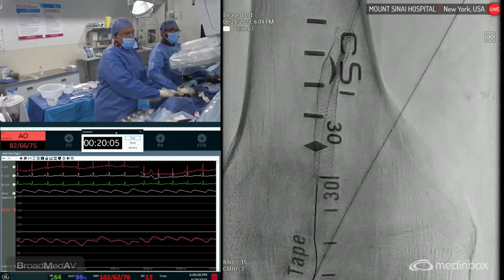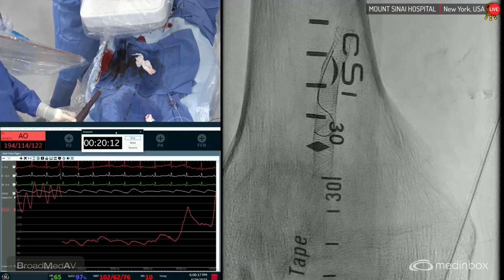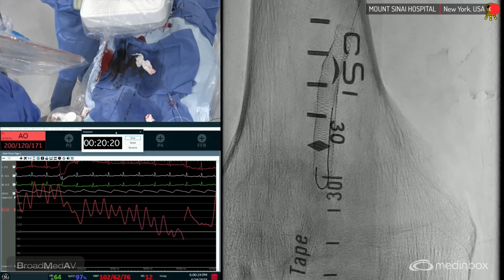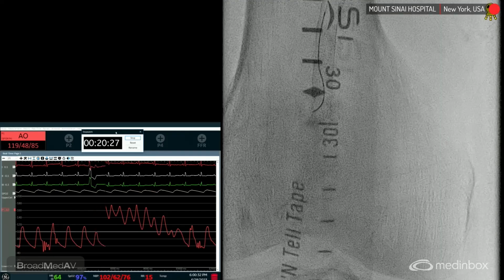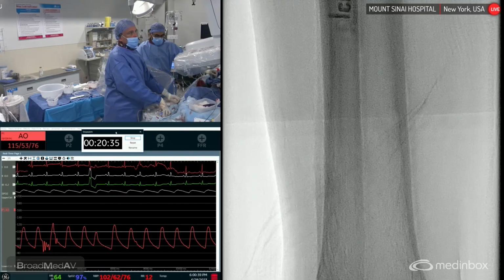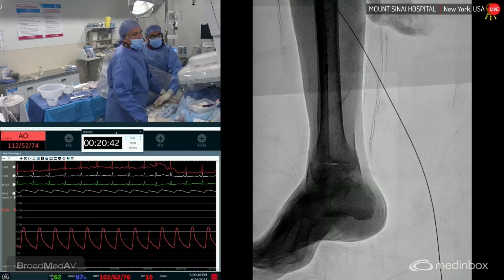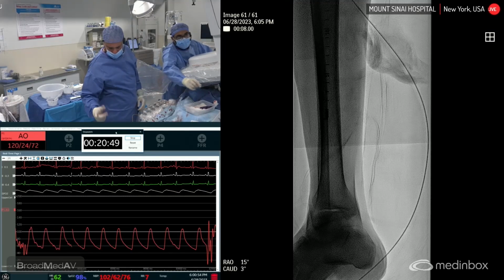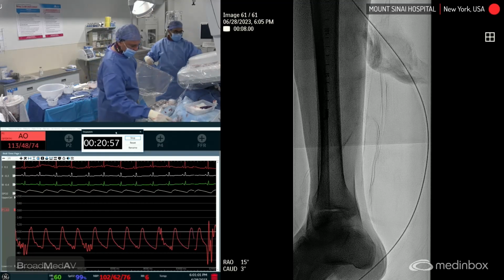Good. So we're going to just walk this out. He's going to lock it. Flora, please. I'm just going to keep the wire in the stent because distally, I'm not too concerned. And then we'll just finish with 2 pictures. And then we'll do the IVUS, like I said, offline. So we'll start with the picture of the foot. Okay, DSA. Okay. Very good.